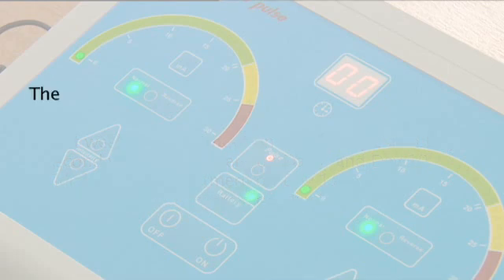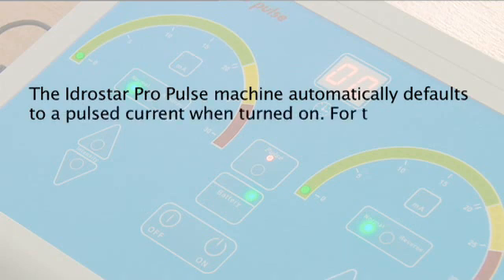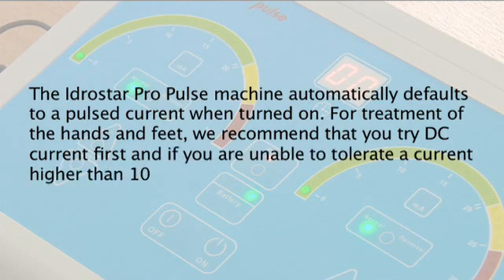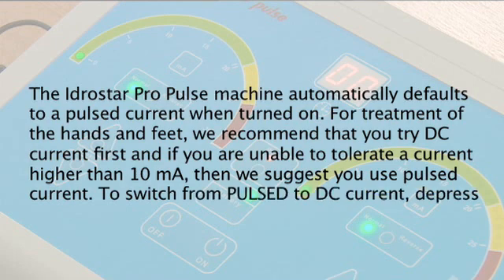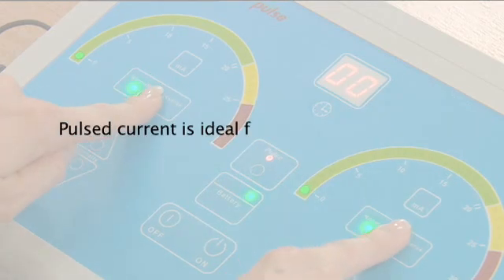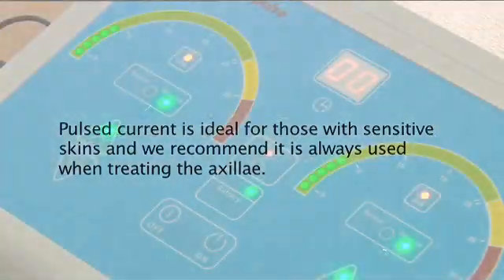The Idrastar Pro Pulse machine automatically defaults to a pulsed current when turned on. For treatment of the hands and feet we recommend that you try DC current first, and if you are unable to tolerate a current higher than 10mA, then we suggest you use pulsed current. To switch from pulsed to DC current, depress the pulse button — no light will be shown, which means that the machine will be in DC mode.